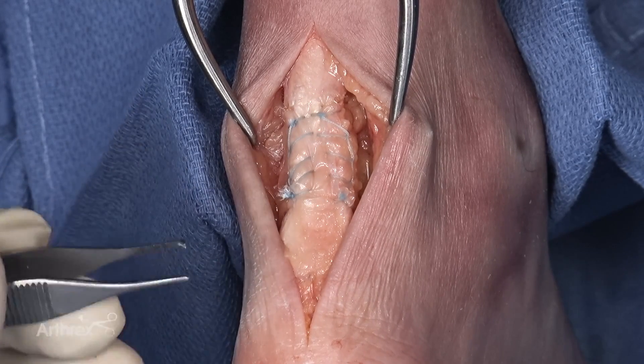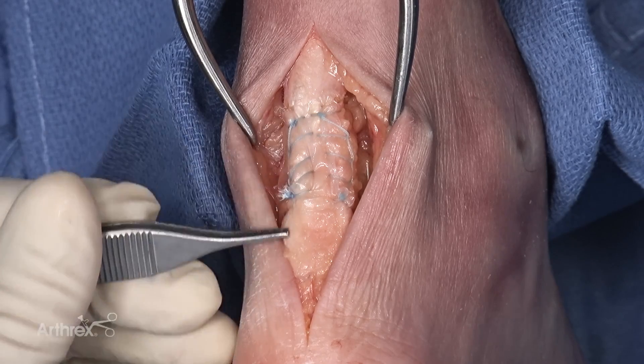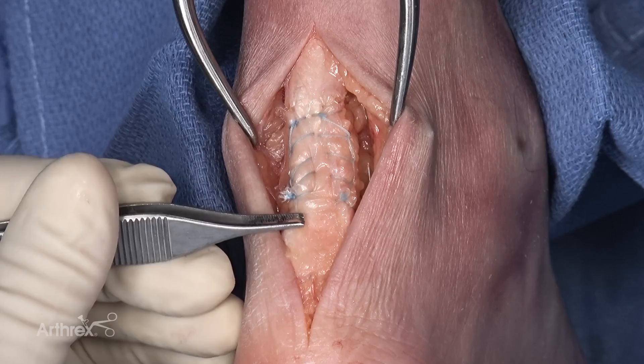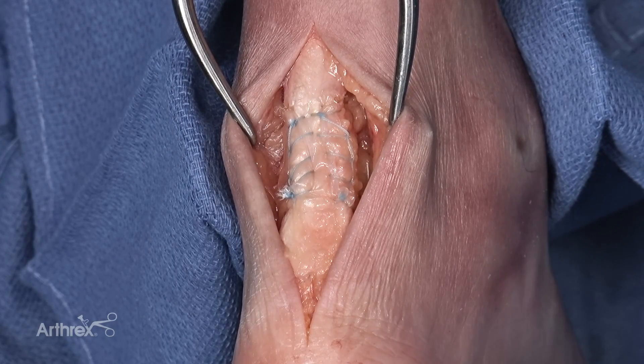One of the things I can't stress enough is that this scaffold has to be well fixated to the tendon. Simple interrupted sutures are not stable enough to achieve tenocyte migration across the scaffold. You also want to prevent any post-operative hematoma from forming between the tendon and the scaffold, so you don't create subdermal friction and ultimately wound formation. This repair is a very simple approach to assisting in the augmentation of an Achilles tendon or periarticular tendon repair.